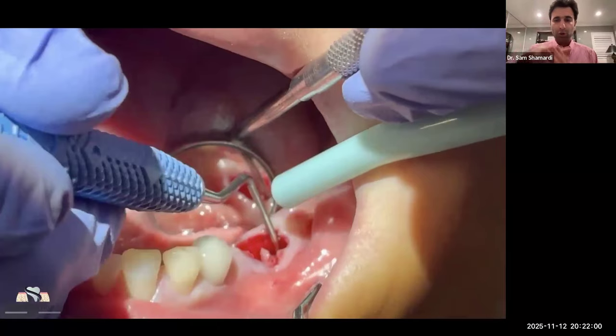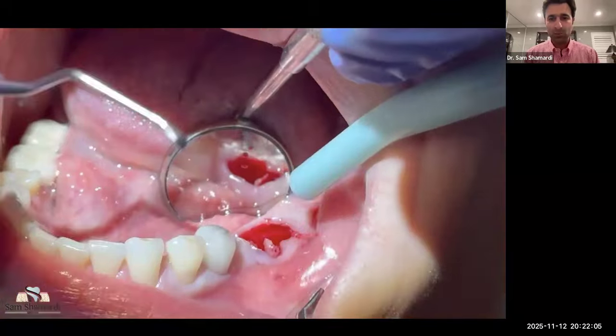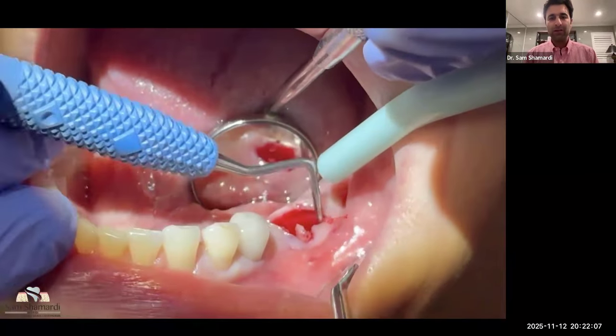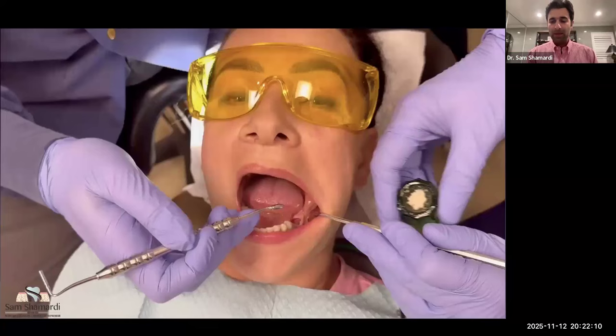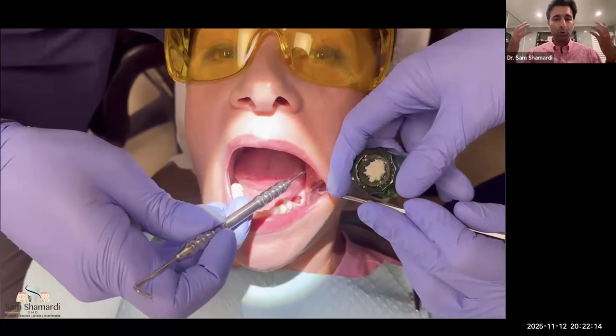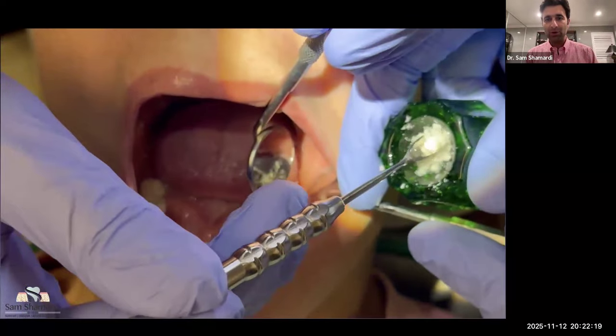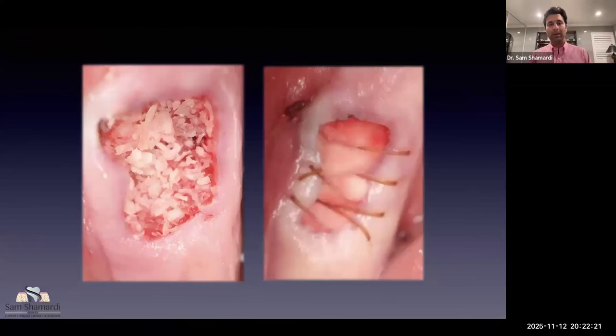After we curette, we put our gauze right back in, and we do this same trick back and forth as many times as we need until we make sure that there is no infection left. And then, of course, we can go through our regeneration process of putting in our bone, our membrane, or our plug, etc. And after we've packed in our bone in that area, we have the situation where we have a nice intact socket. We have the area covered, and we put our sutures there to keep nice pressure on that spot. So our goal at the end of the day is to approach all these cases the exact same way.